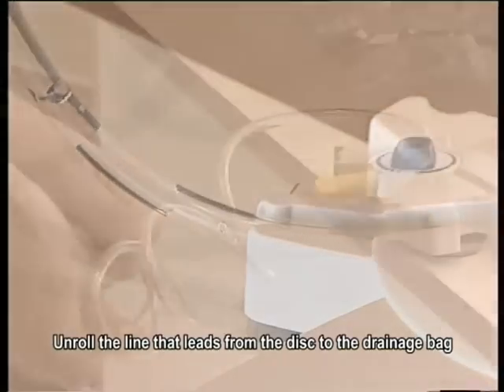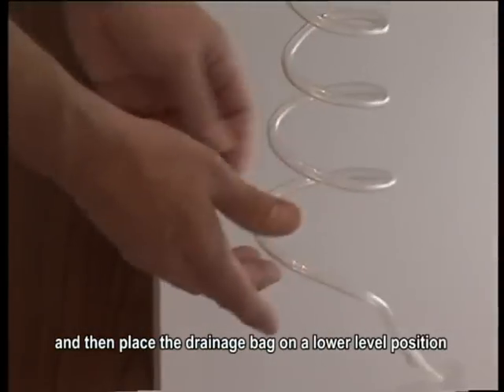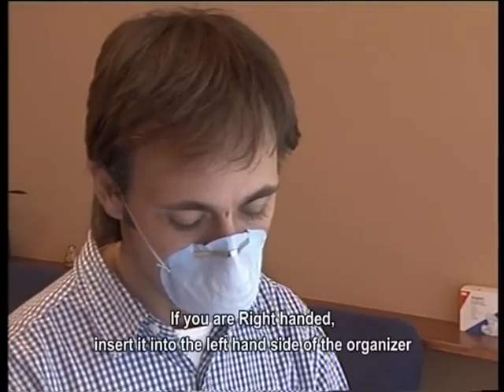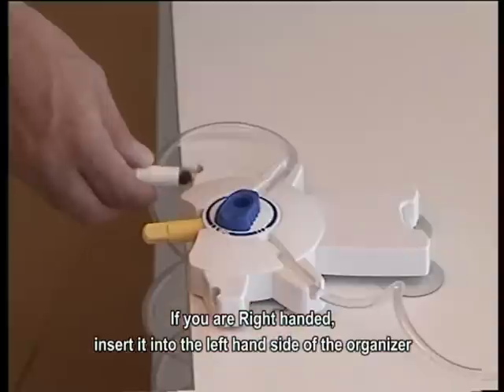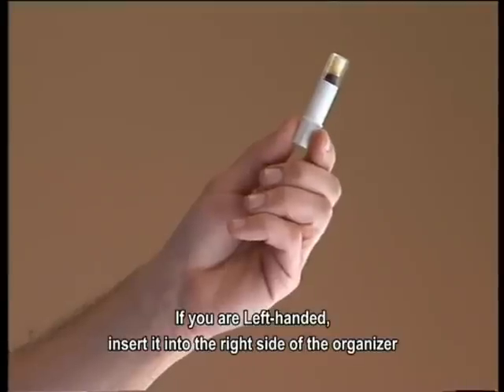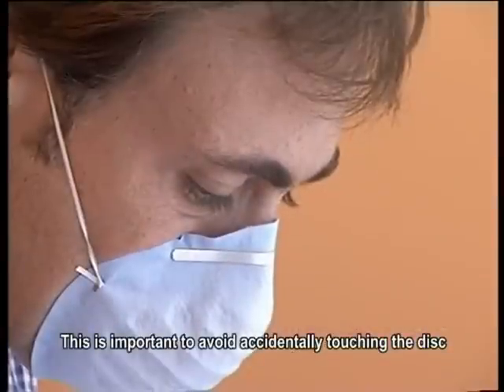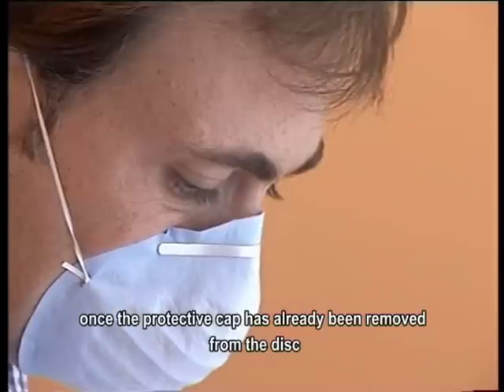Unroll the line that leads from the disc to the drainage bag. Then place the drainage bag on a lower level position. Place the disinfection cap into the organizer. If you are right-handed, insert it into the left-hand side of the organizer. If you are left-handed, insert it into the right side of the organizer. This is important to avoid accidentally touching the disc once the protective cap has already been removed from the disc.